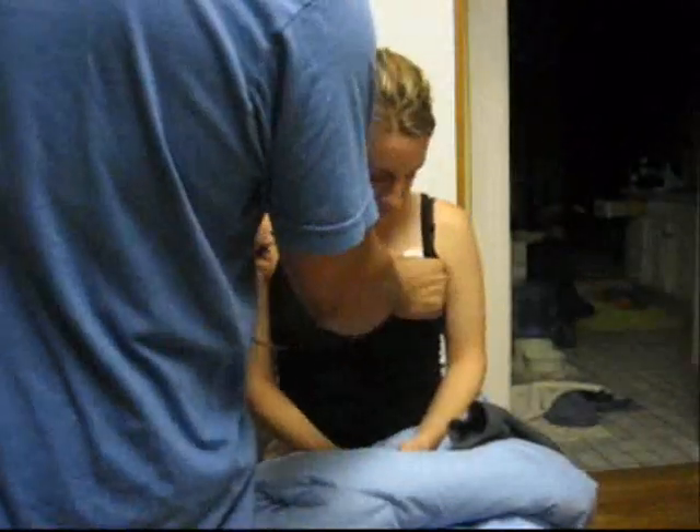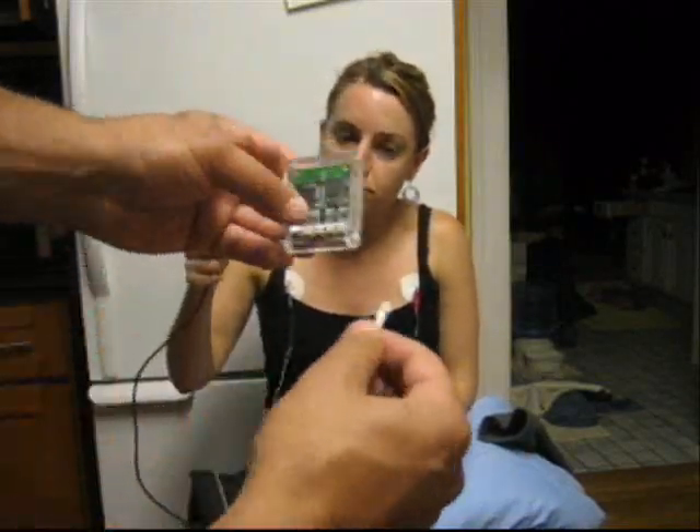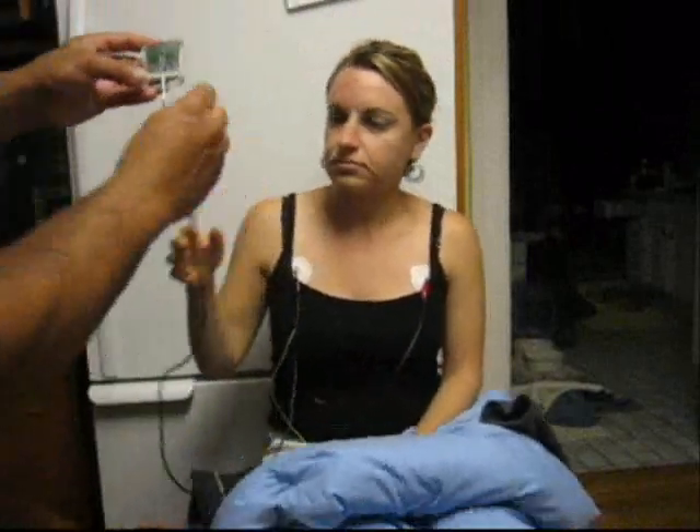In the next segment, I will demonstrate the ECG recording functionality of the health monitor. We are currently using standard silver-silver chloride electrodes for development purposes but plan on incorporating all sensors into a chest strap. Two sense electrodes and one ground electrode are placed on the user and attached to a shielded cable. First, the battery is attached to the health monitor. Next, the ECG leads are connected.